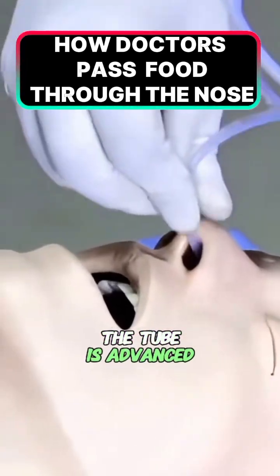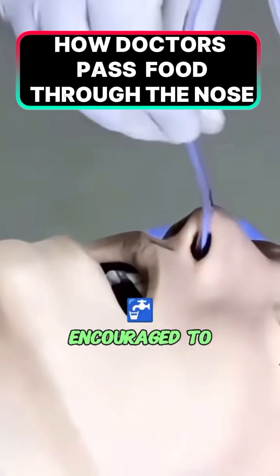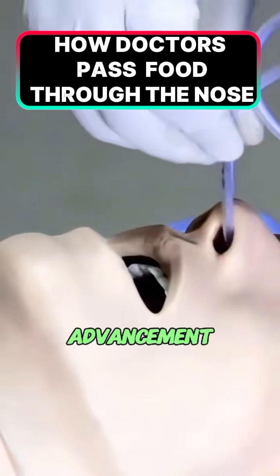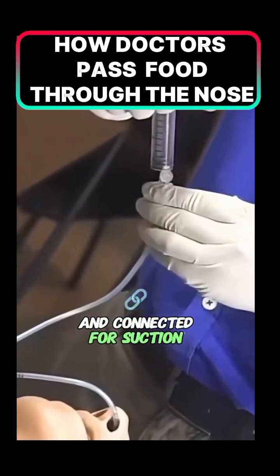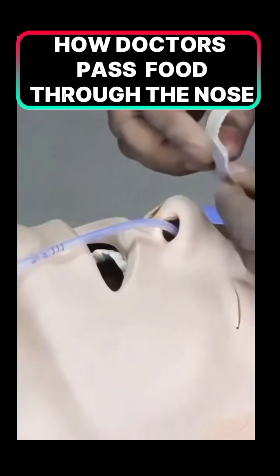The tube is advanced straight back toward the oropharynx while the patient is encouraged to sip water and swallow to guide the tube into the esophagus. Advancement continues until the pre-measured mark is reached and connected for suction, feeding, or kept clamped as required.